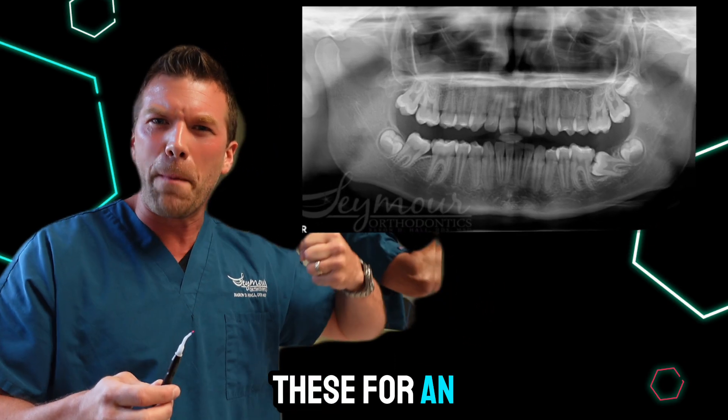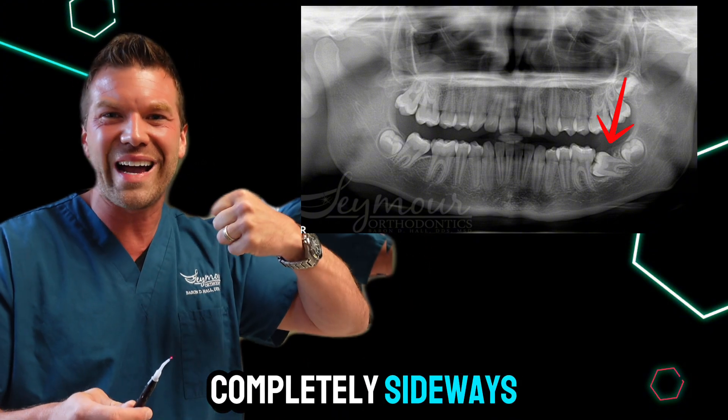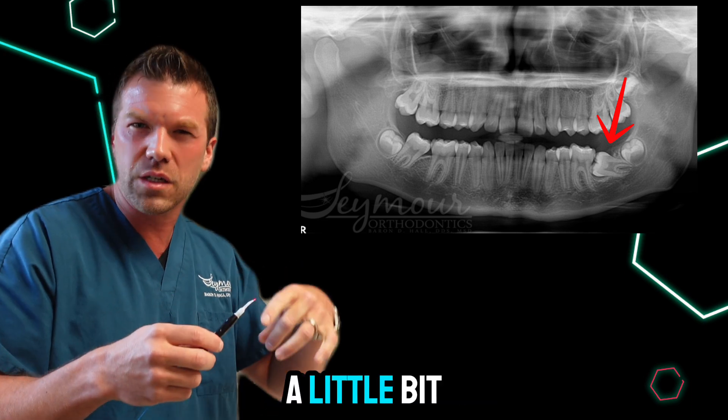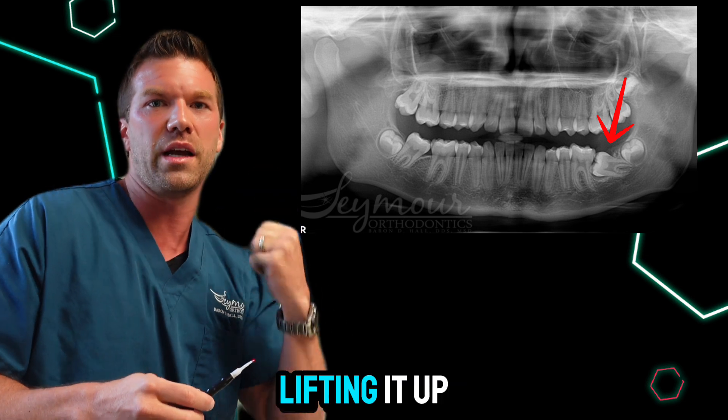Sometimes we'll use these for an impacted tooth that looks like this. You see this molar is coming in completely sideways. So we use a soft tissue laser to remove a little bit of gum tissue so that we can put braces on that tooth and then keep lifting it up.